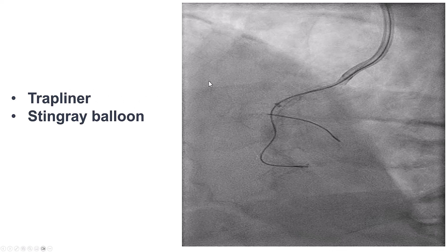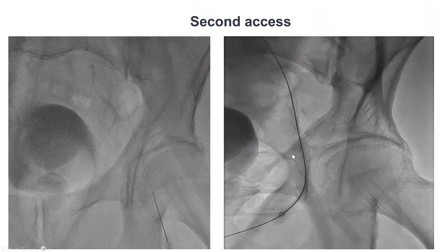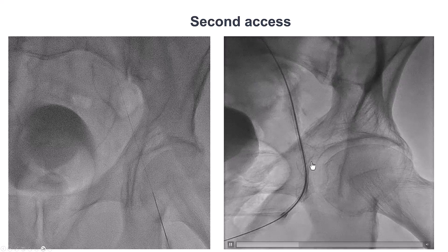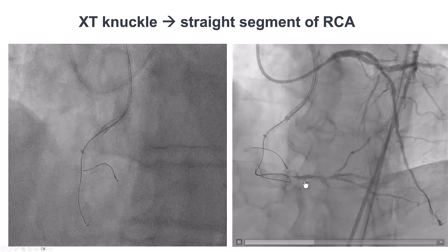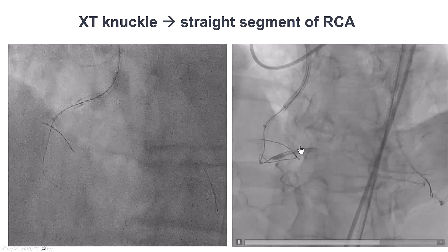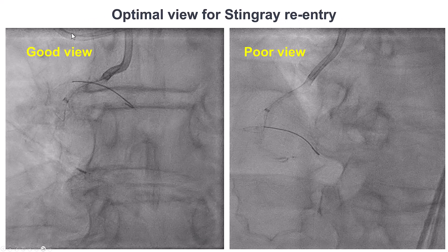We used a Trapliner and delivered a stingray balloon. By this point we had lost visualization of the distal RCA and the PDA, so we obtained a contralateral femoral arterial access to visualize. We used a Fielder XT to deliver the stingray balloon in the distal straight segment of the right coronary artery and oriented the view to allow optimal visualization. This is the view we like, in which the stingray appears as a single line rather than a tram track, confirming we are perpendicular to the exit points of the balloon.